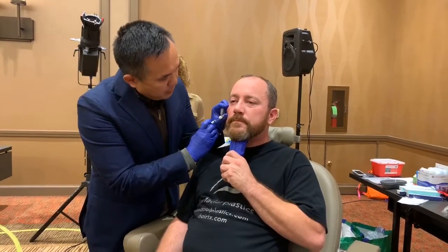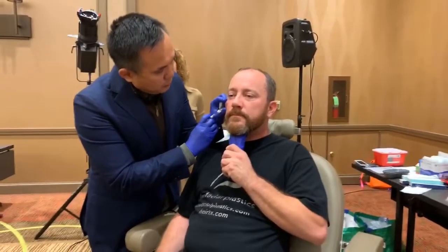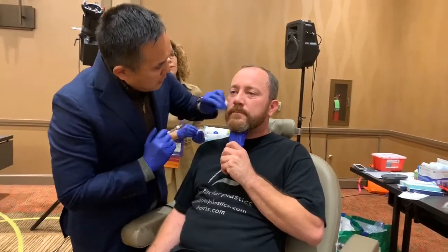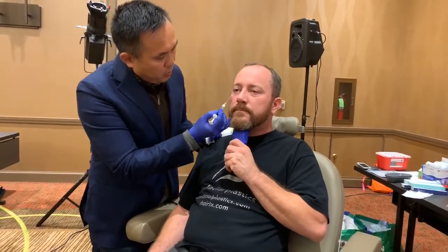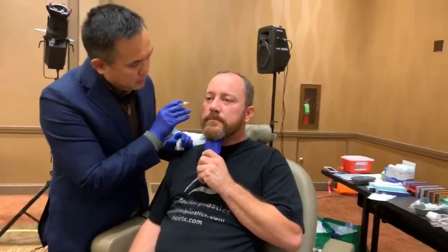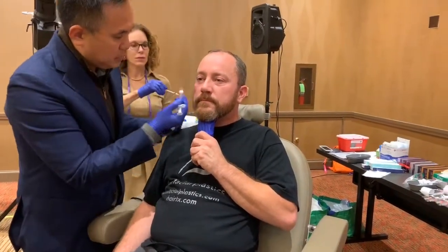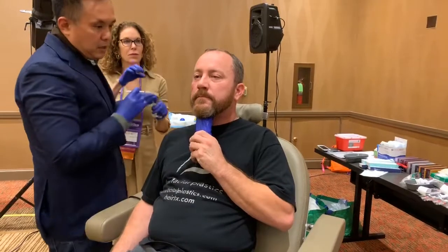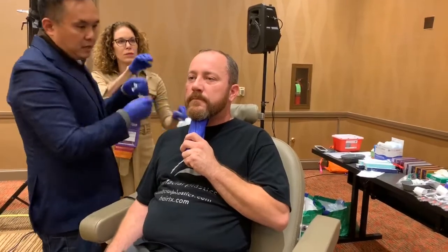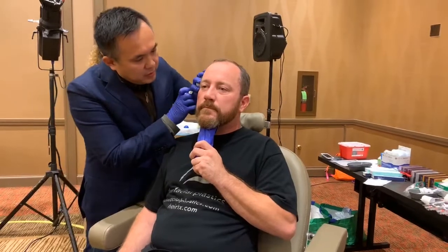Pretty much 90% of my filler profile is Restylane. I use Juvederm for the lips; sometimes I'll use Restylane for that as well. For the lateral portion I go one of two ways — either horizontal or backwards. Because there's a little lateral dip that extends medially, I'm going to make another entry and go in there. I pinch and shake so there's less discomfort. Everyone knows the gate theory of pain — I'm very focused on comfort.